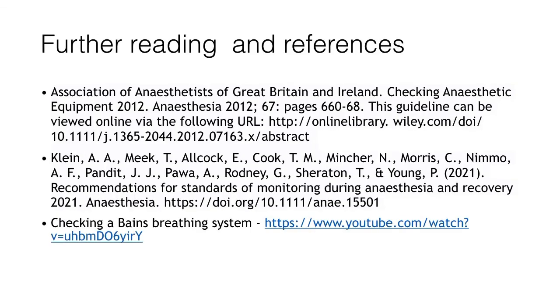Finally, there are a few references here and some further reading points with some links to some guidelines on monitoring and checking specific breathing systems such as the Bain circuit.